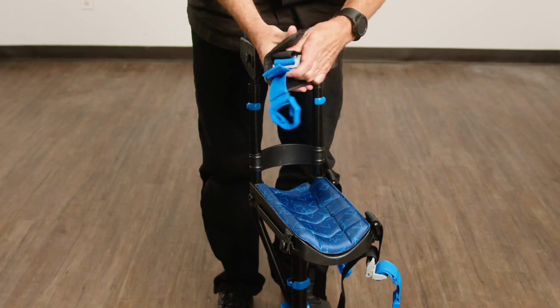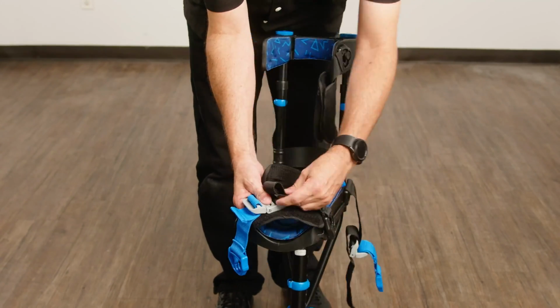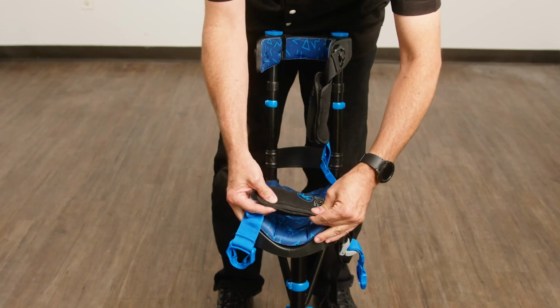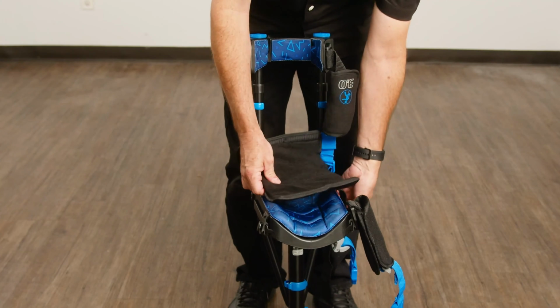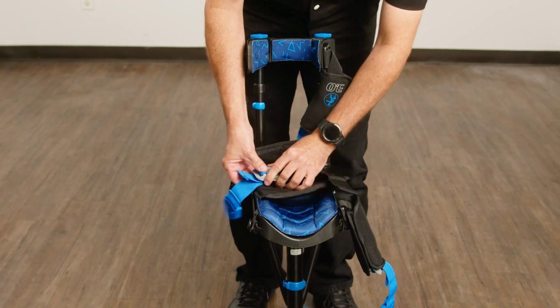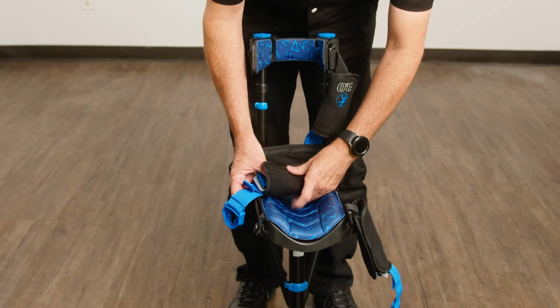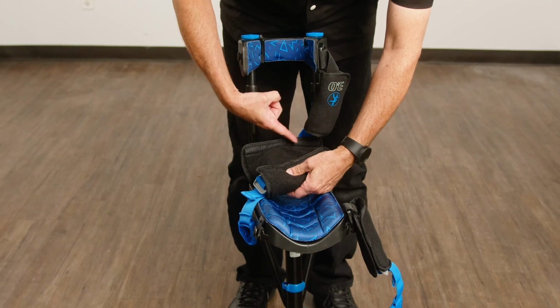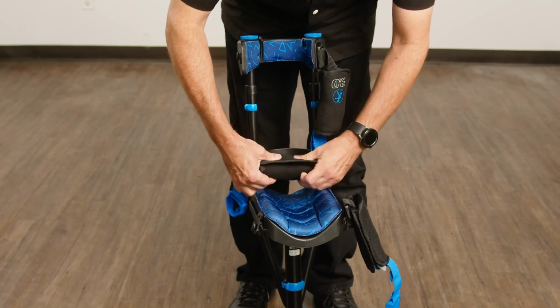The smaller pads with the logo go on the upper thigh and calf location. The larger pad goes on the knee strap. Before you install the pad, lengthen the black section by approximately ½ inch. Then install the pad. Wrap the pad as tightly as possible. Note that the Velcro strips attach to the fabric, not to each other.